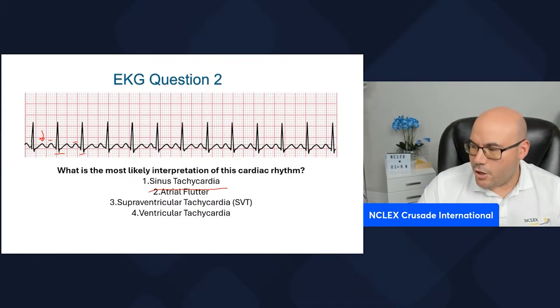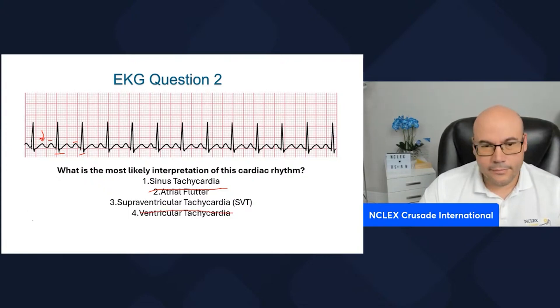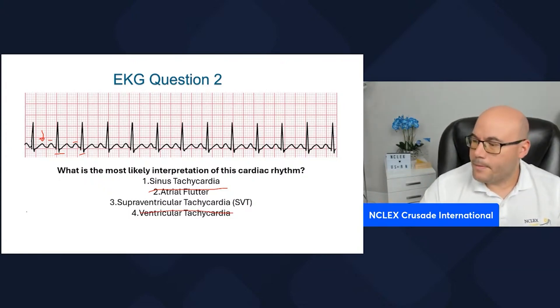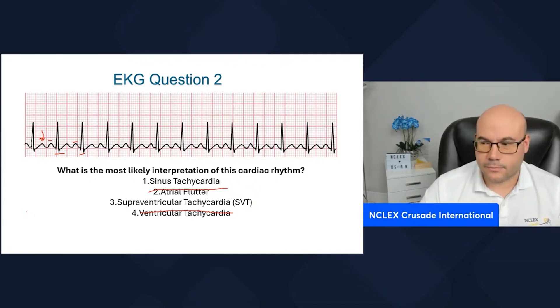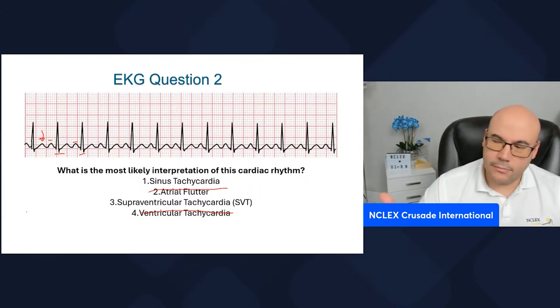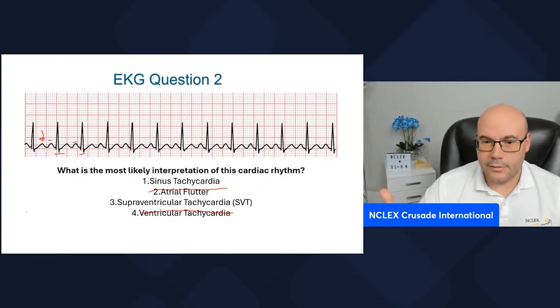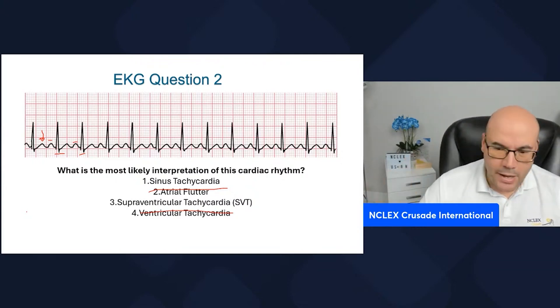This cannot be ventricular tachycardia either, because ventricular tachycardia doesn't look like that — we're going to see that another day. So we have left either sinus tachycardia or supraventricular tachycardia. We have a regular rhythm, a high heart rate of 130 beats per minute, a normal PR interval, a normal QRS, and a P for every QRS.